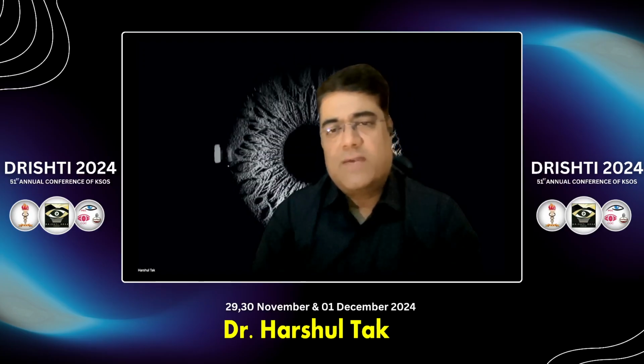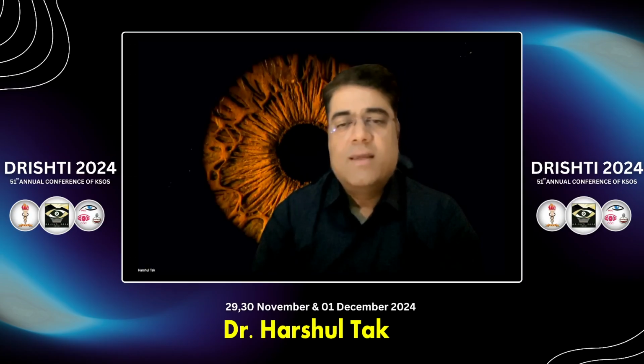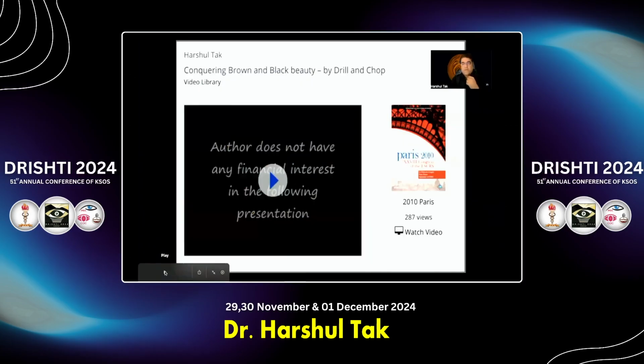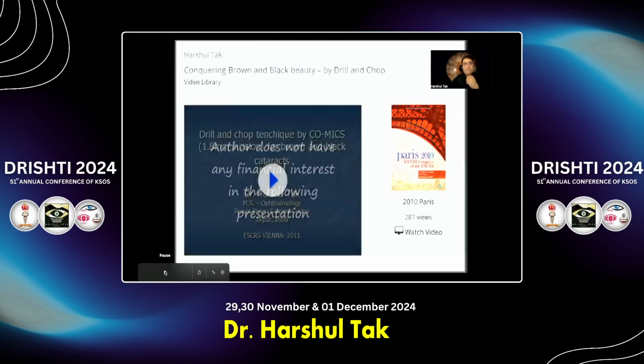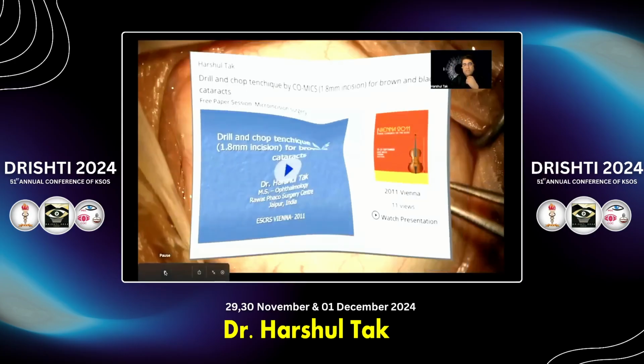We all know that dealing with these kinds of cataracts is challenging even for an experienced and skilled phaco surgeon. The technique which I use to deal with brown and black cataracts is what I call the drill and chop technique, which I presented at ESCRS Paris 2010 and at ESCRS Vienna in 2011.